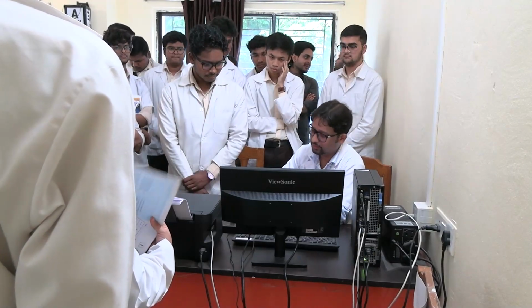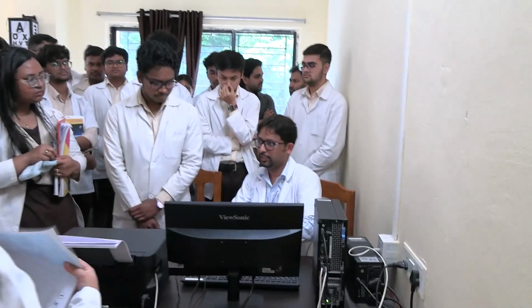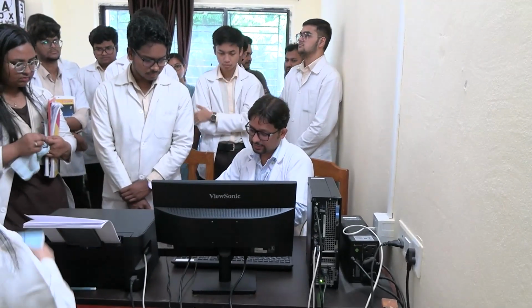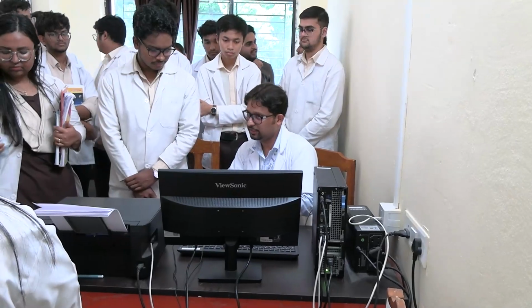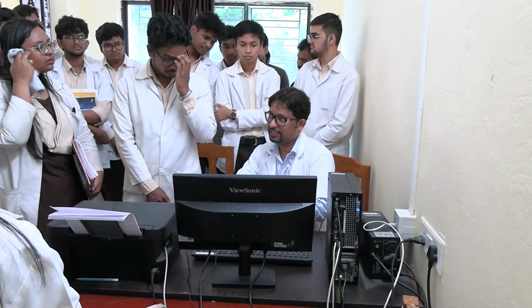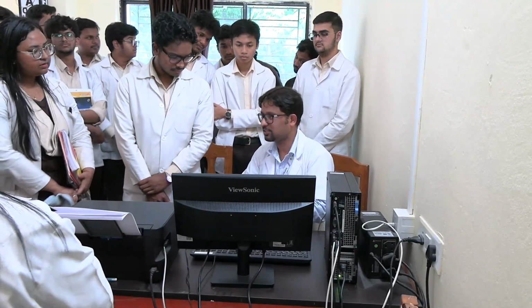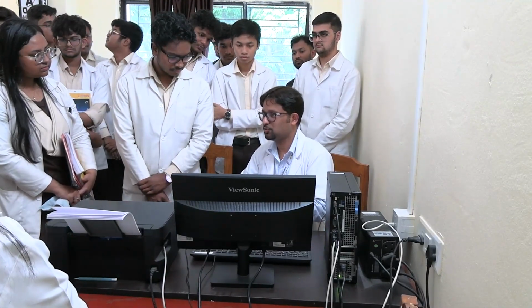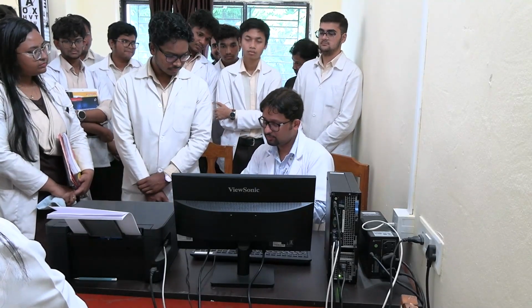So you have to inhale with your nose first. So deep inhale as much as you can, right? At the time of exhalation, because it is a dynamic thing, the emphasis is as much as you can exhale and as fast as you can. Both are important. So here we are adding one more component in the instruction. As much as you can exhale and as fast as you can. So both of these things have to be ensured.